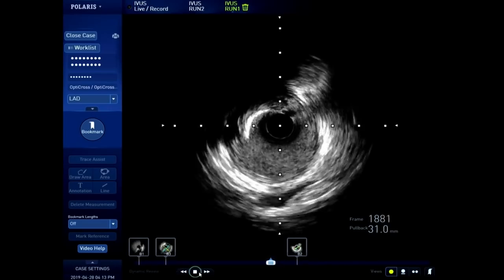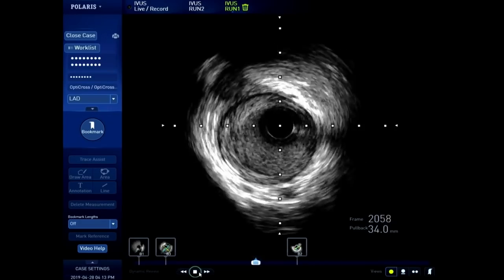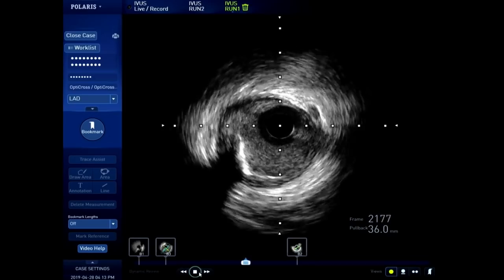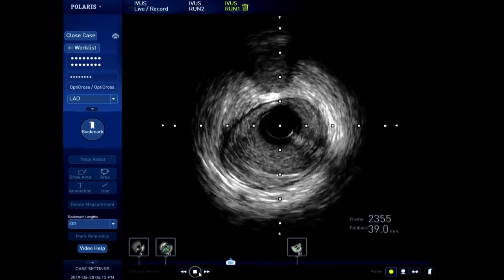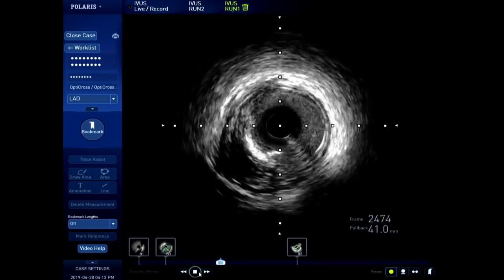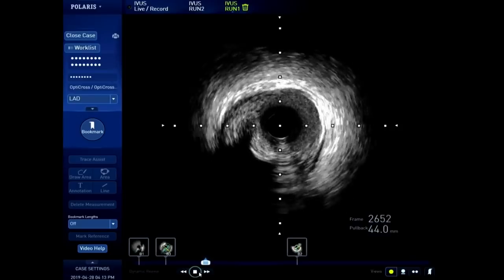Minimal lumen area is clear. Yes, good. Here the proximal part looks normal. This is the vessel region over here, and proximally there is a huge plaque over here. Ramus, and also there is some calcium. Definitely proximally there is a huge plaque.